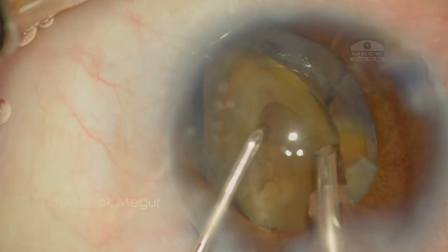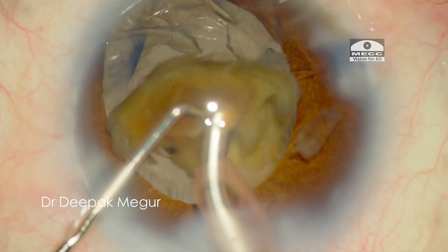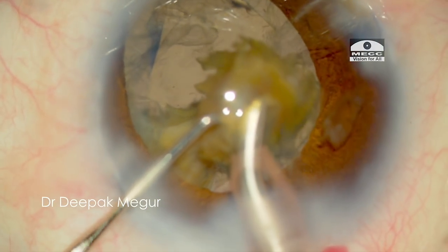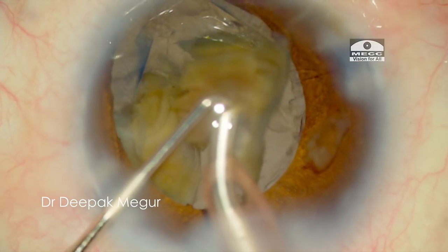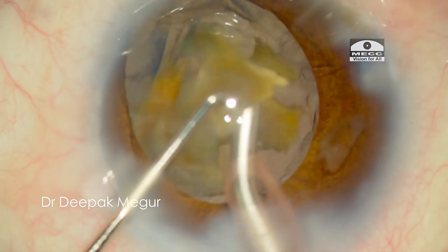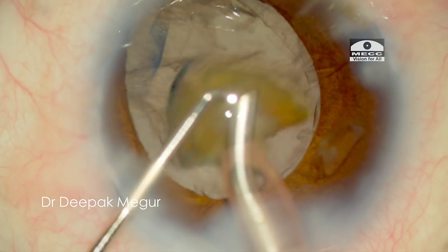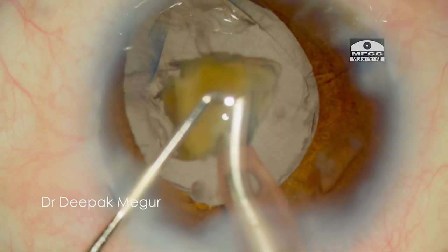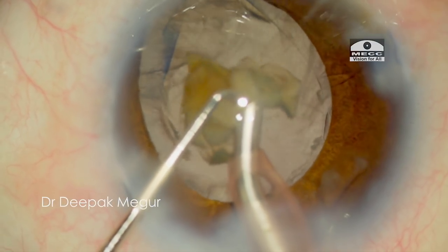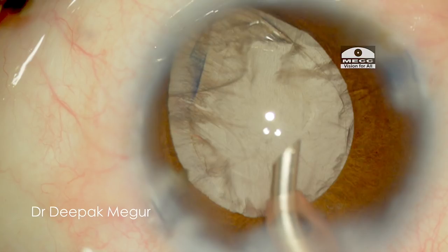After each fragment removal, I am putting OVD to ensure less trauma to the endothelium. Because the rhexis is torn, I am emulsifying the fragments at a much more anterior plane than I usually do. My focus is predominantly on the torn rhexis edge, ensuring it is not extending. Minimizing turbulence inside the chamber will help minimize trauma to the endothelium. The parameters are such that lens chatter is minimal, and once the nucleus is stuck to the tip, it should dance around the tip without leaving until totally emulsified. I am using my chopper slightly above the level of the fragment to prevent it from flying anteriorly and hitting the endothelium. At the end, I was relieved having completed the toughest part of the procedure.